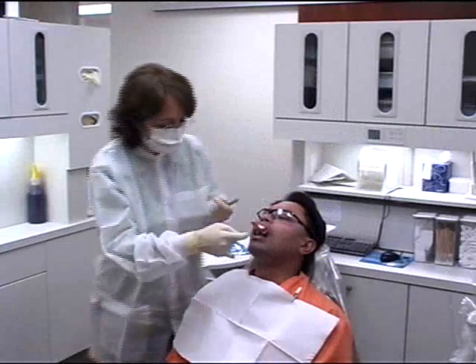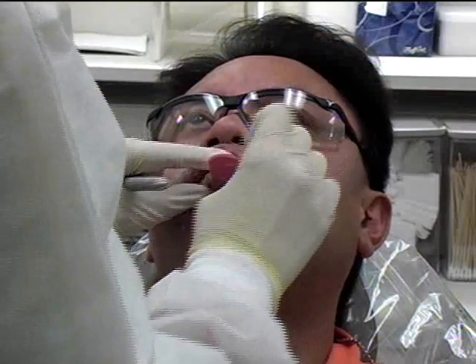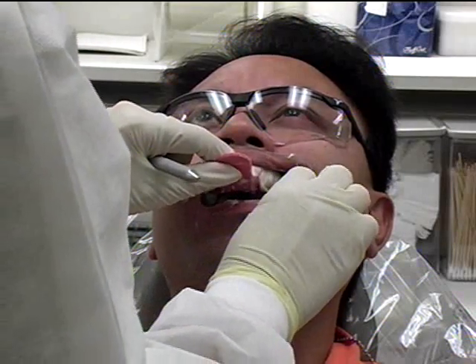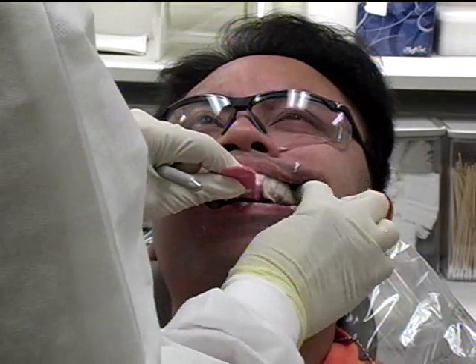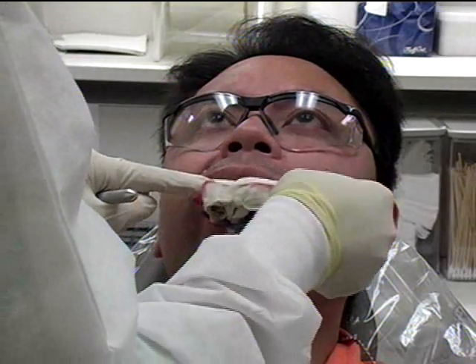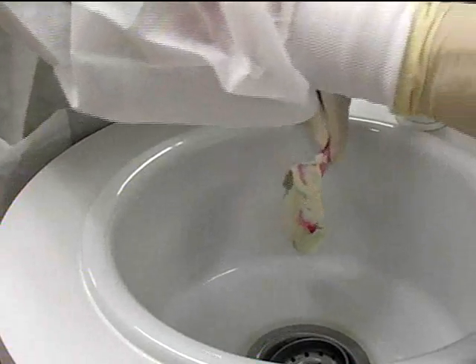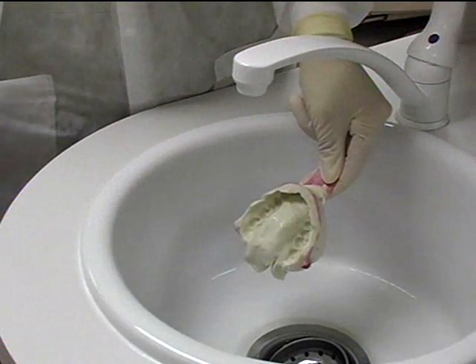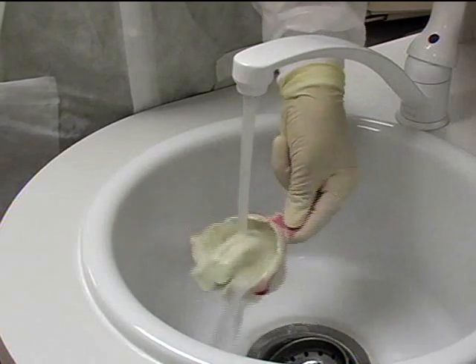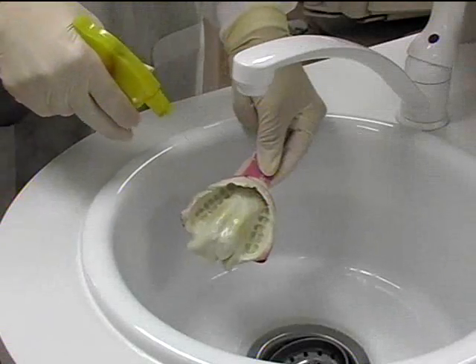After 3 to 4 minutes, stand in front of the patient and gently elevate the lips and cheeks to free the tissues from the alginate and to break the peripheral seal. Dislodge and remove the impression in a single rapid motion. Rinse the impression under tap water to remove saliva. Spray with a disinfectant.